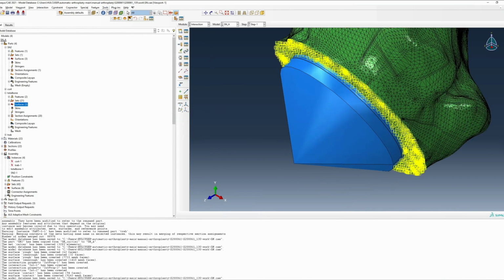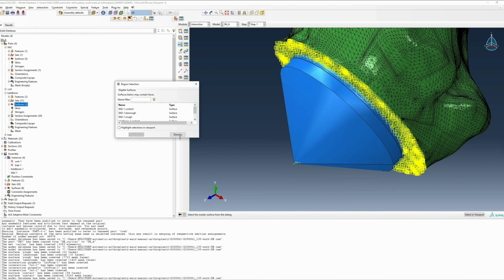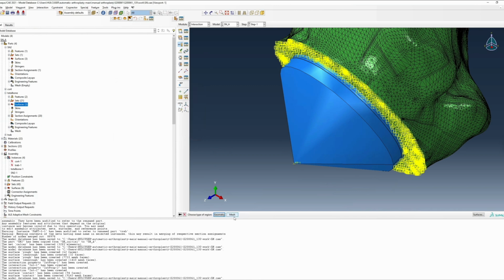We've now finished up with our surface-to-surface interactions, so I can continue on to distribute my load across my surrogate implant surface. For my implant, I want to apply load at the center of rotation of my implant, which is shown by the peak of the cone on my implant model. In order to apply this without causing a stress concentration, I need to create a constraint through the creation of a reference point, and applying the force from that reference point to the rest of my cone surface.